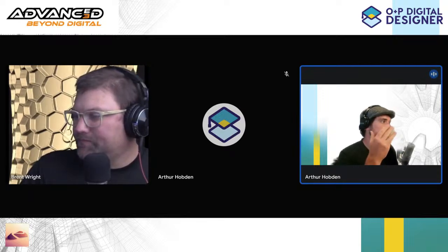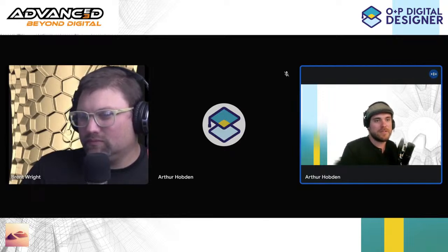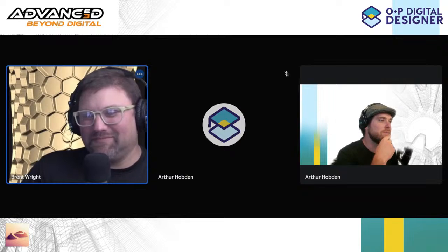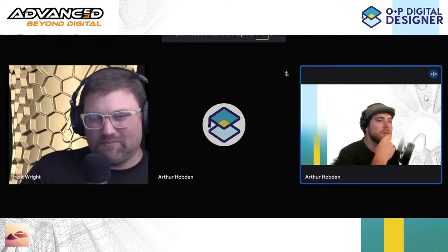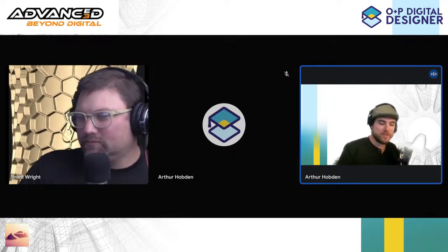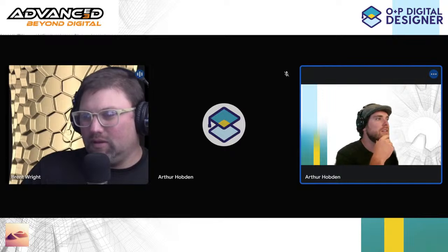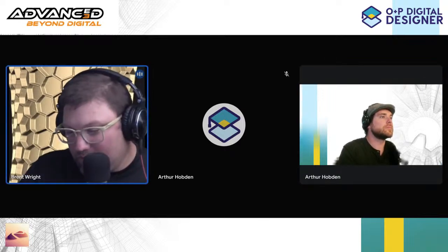Cool. Yeah, and especially circumferences. Like CAD packages don't do circumference. Fusion 360 or SolidWorks, it's just not something I've seen that any of them do well. Interesting. Yeah, that's the one thing ONP software has right now over traditional stuff, being able to measure with that.